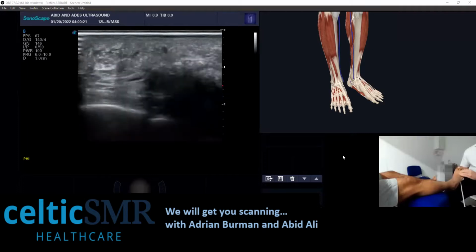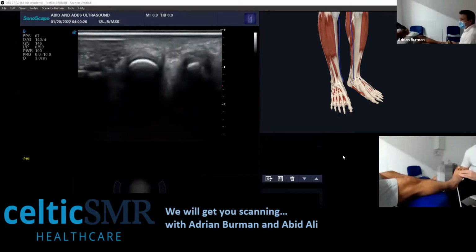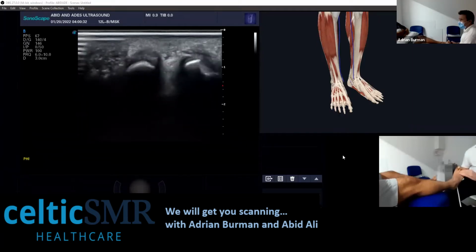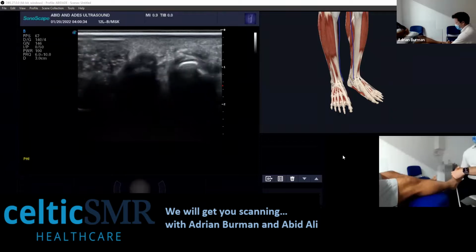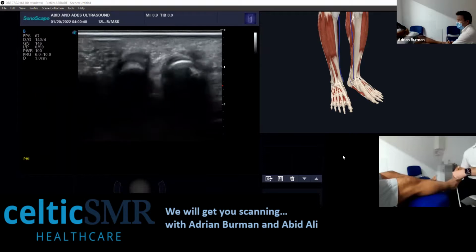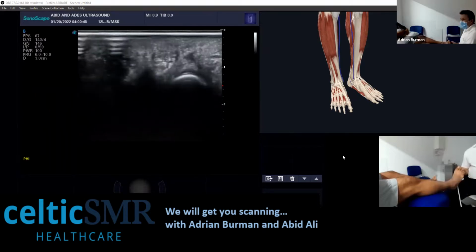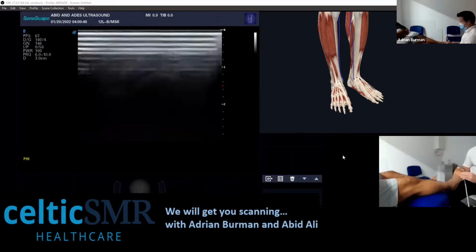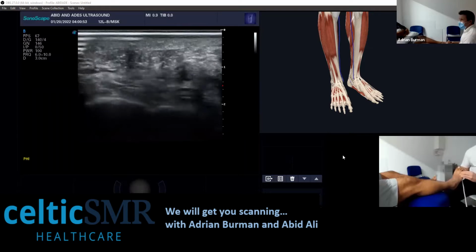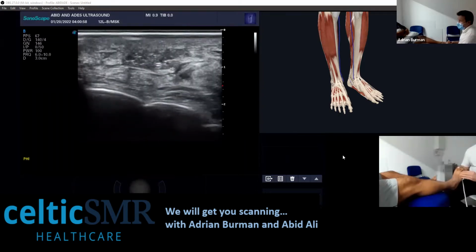Yeah. So not seeing anything in that one, and then I also look transverse as well. So I do both, and I push up, and I can see I'm pushing the right one because I can see that movement at the bottom. Okay, and you can use my thumb. There's really nothing. It's all bright in the middle. Not seeing anything, and I may even do little Mulder's clicks as well to see if anything pops up. And I do that to all of them. So I go to the next one, angle into the space, push. Nothing there. You can see the bit of the nerve going along there. You can see how it jumps.